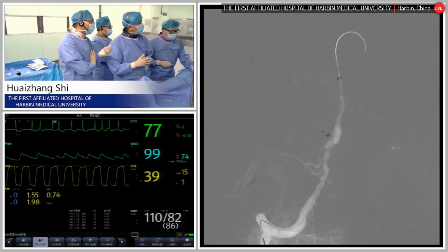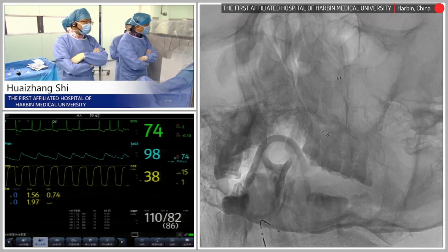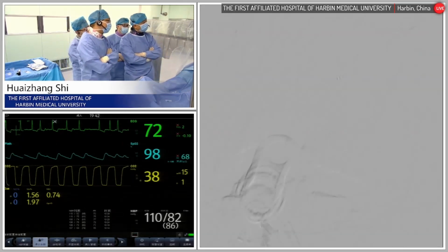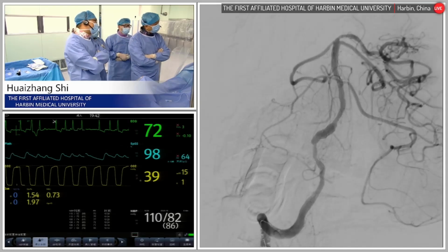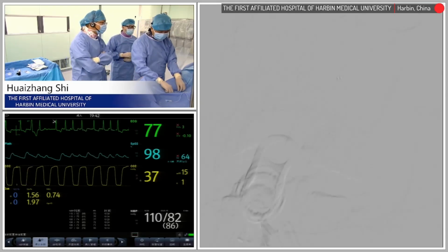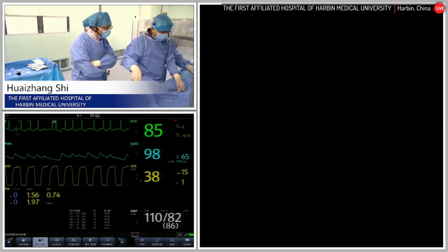We do angiography first to see whether there's some spasm. So before the release of the stents, I think it's good. It's good. Okay, give me. So single and microwire. Yes.